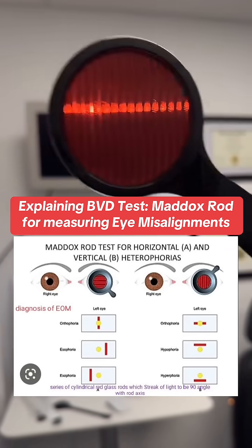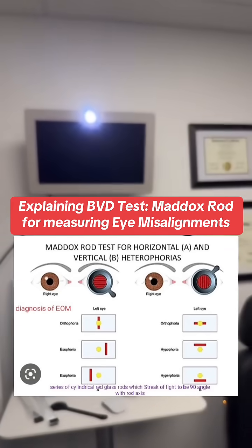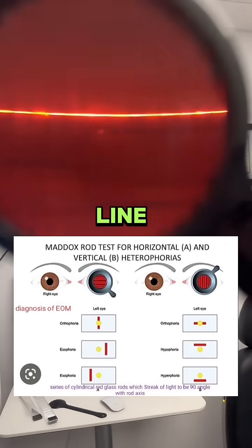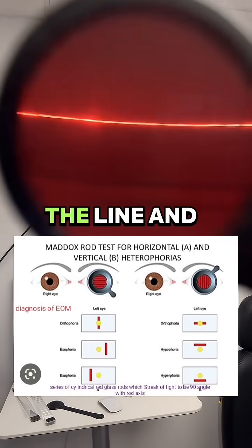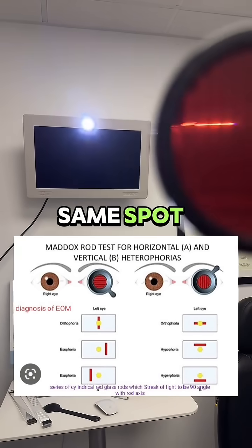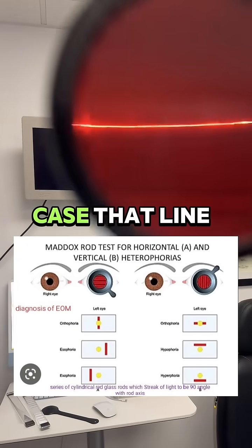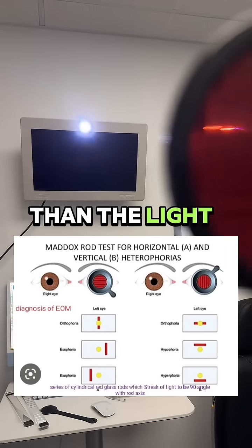So that's what you're seeing: one eye sees the light and the other eye sees this line. As you can see, the line and the light should be in that same spot, but when you have a misalignment — like in my case — that line was much higher than the light.